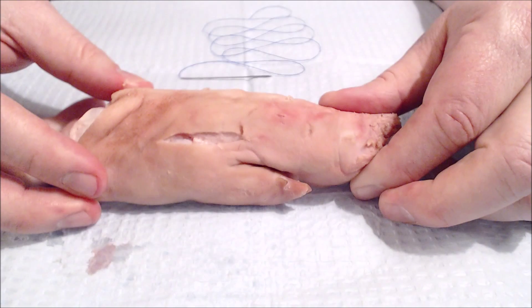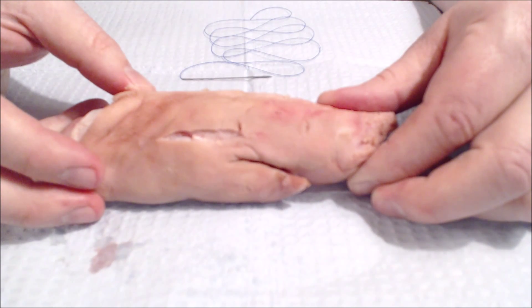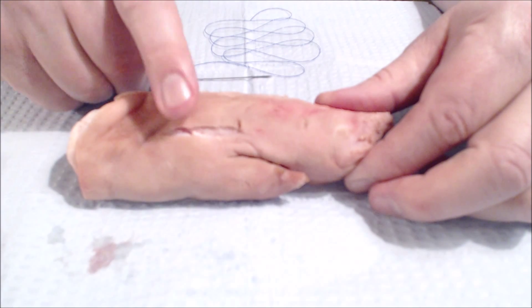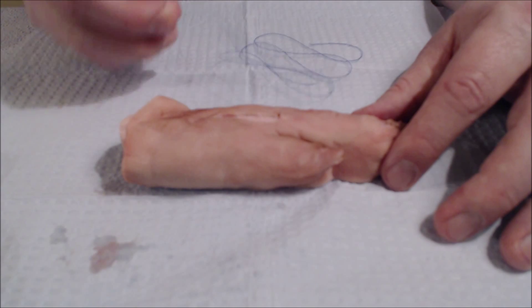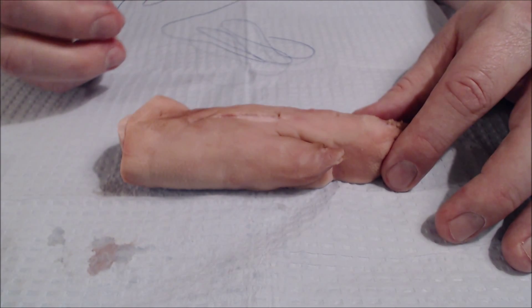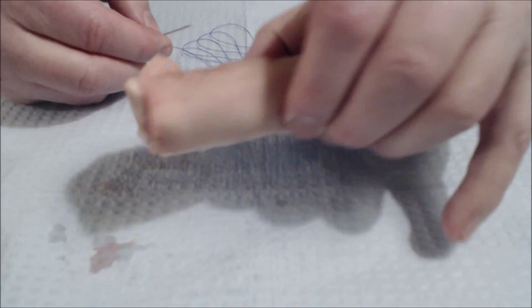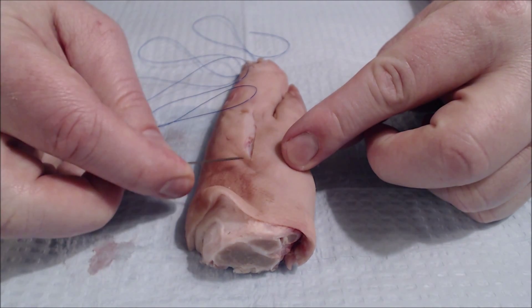To simulate something more like what we'd run into in the field, I've cut open kind of a gash here. This is usually what it looks like when someone lacerates their arm or leg in the field, and I encourage you to make that when you're practicing your sutures. In this video we're going to run sutures all the way up and down here — this is a very fast, quick way to close the laceration in the field. It's easiest when you're practicing to start distally, or furthest away from you, and then sew towards yourself.